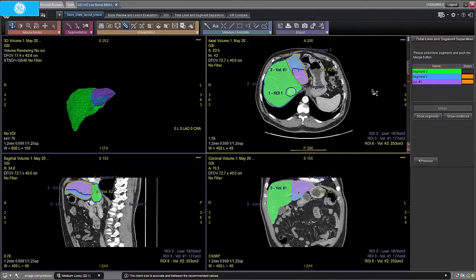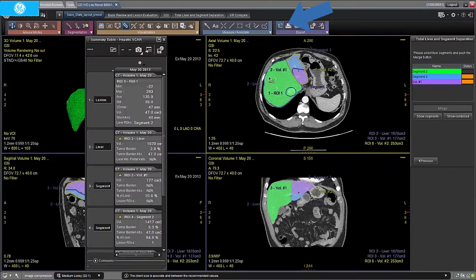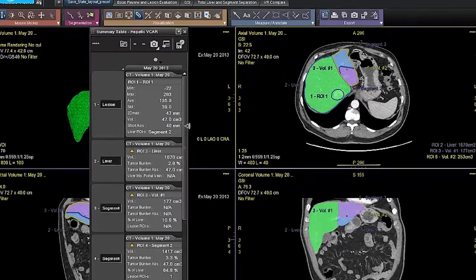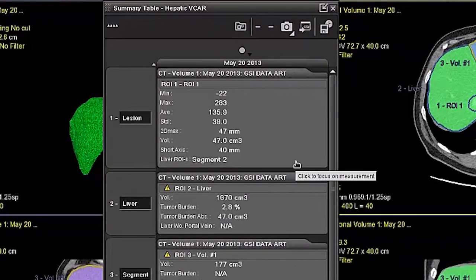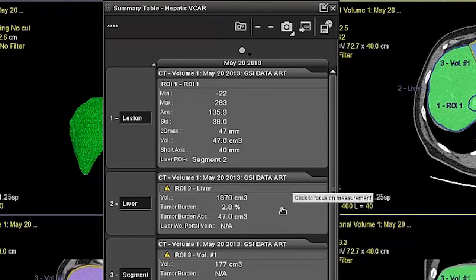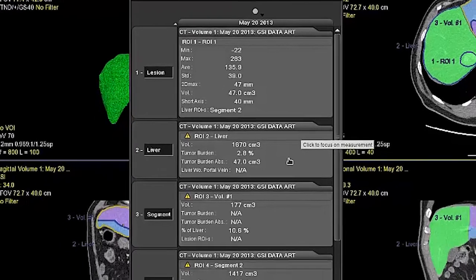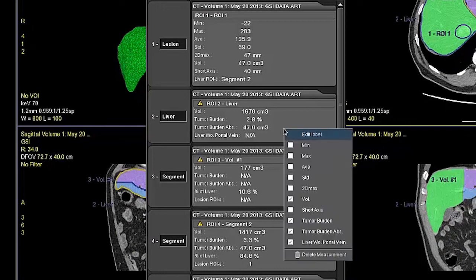The result of the new segmentations will be added to the summary table along with the lesions and the liver selected in the prior step. Statistics include volume and tumour burden. We can add more measurements under right-click.